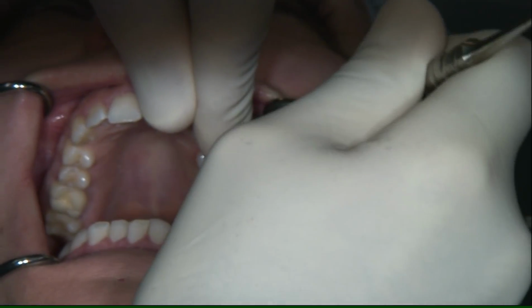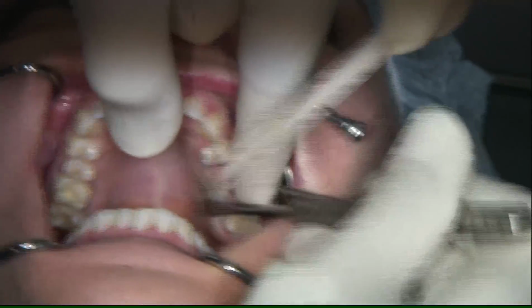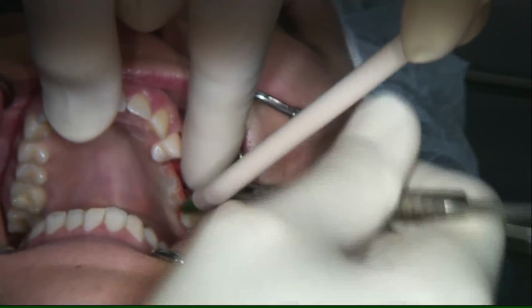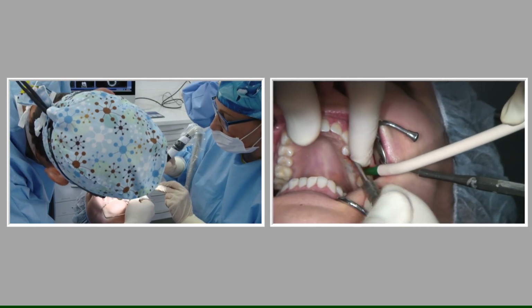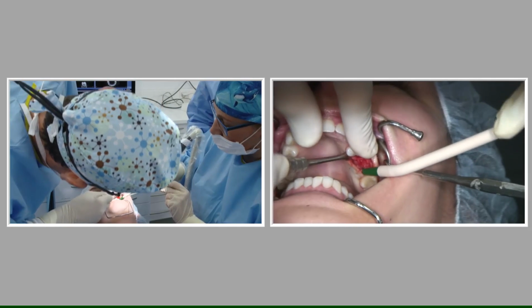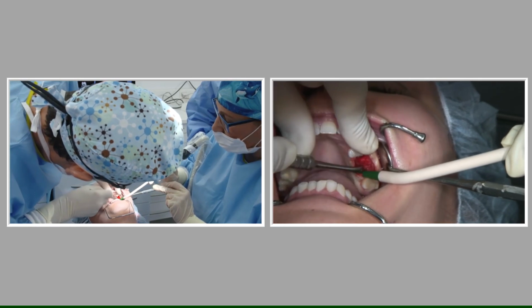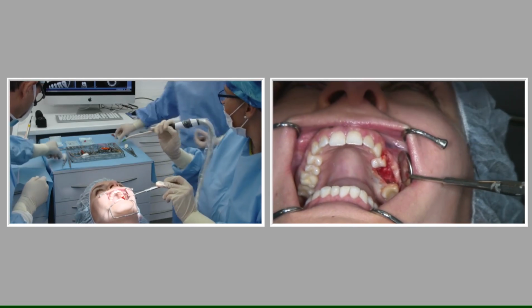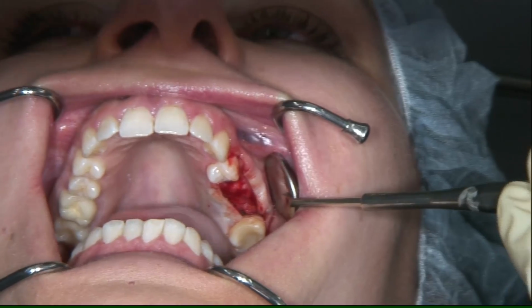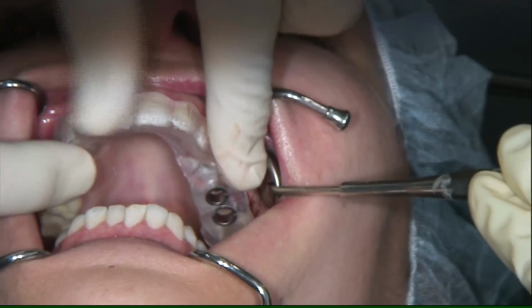And this is the reason why it's preferable to have a CBCT before, a three-dimensional picture before, to do some backward planning, to see do we have some bone resorption or not. And in this case the CBCT was performed with Galileos, and we did the backward planning in the Galileos implant software, also to see critical anatomical structures in the CBCT before the operation. And here you see the use of the OptiGuide.